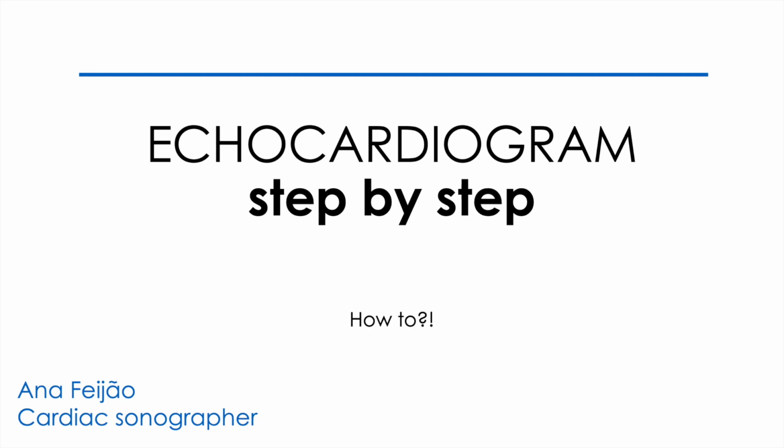I'm a cardiac sonographer working in Angola, and I'm here to give you some tips to apply in your echocardiography exams. I apologize for my English, which is not the best, but I will try to speak slowly. After releasing some videos with the basic concepts of performing the transthoracic echo, I received feedback with questions related to the practical part. This is how this project came about, approaching the step-by-step of an echocardiographic study in order to answer the various questions that arose.